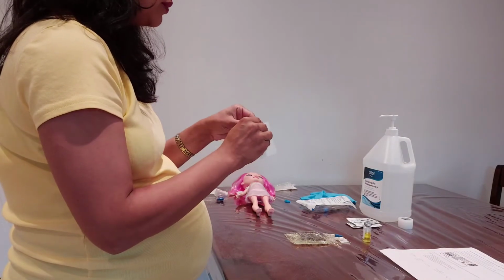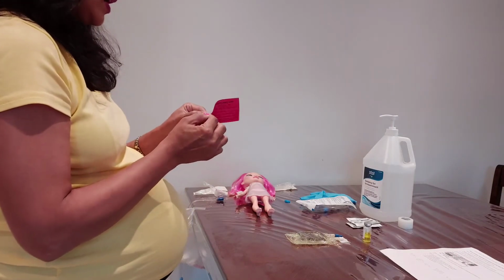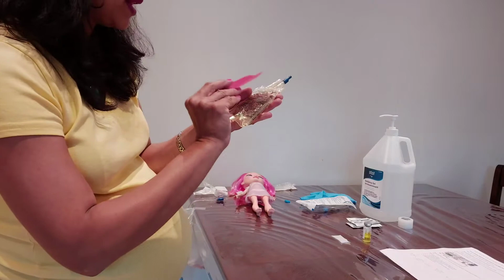So now I will put the label on the mini bag, but I have to put it at the back of the mini bag.